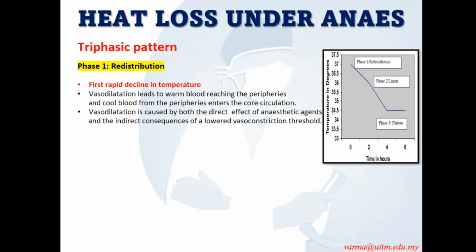That is the idea that I always say. When the patient comes into OT, immediately put in the warmer. Don't start the warmer after you induce the patient. The moment you induce the patient, the redistribution has already started. Then you even have difficulty rewarming the patient to a set point. So that is phase 1, because of redistribution due to a vasodilatation effect.